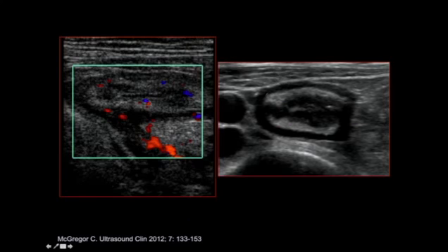This is another patient with Crohn's disease that beautifully demonstrates the transmural linear ulcerations that these patients can have, and this is again another relatively specific finding for Crohn's disease and will help you to narrow your differential in the cases of terminal ileitis.